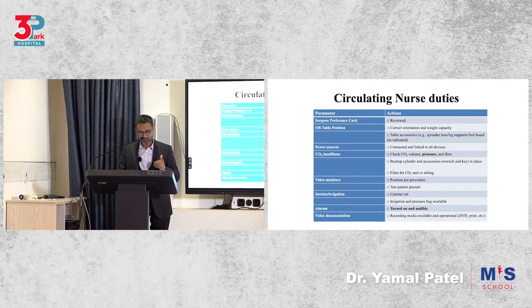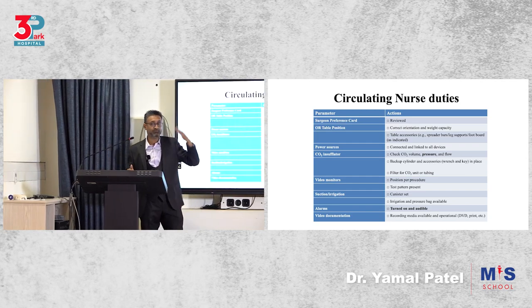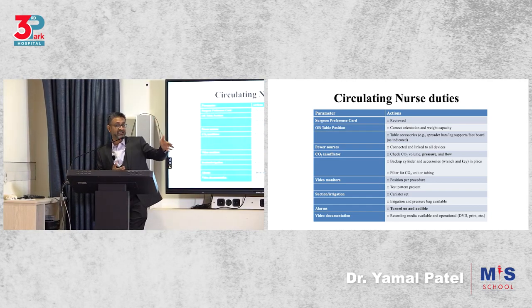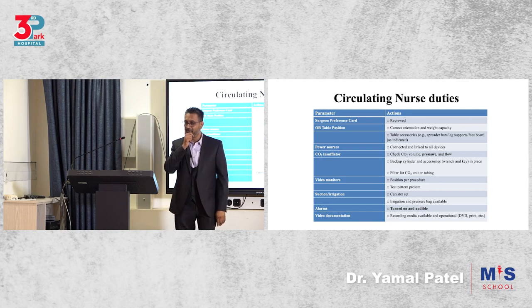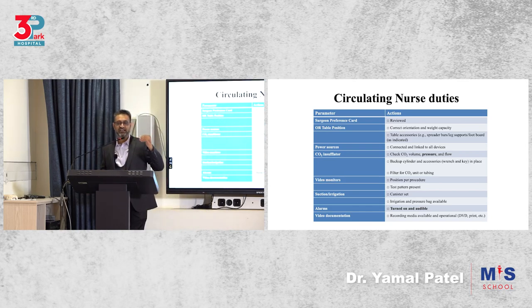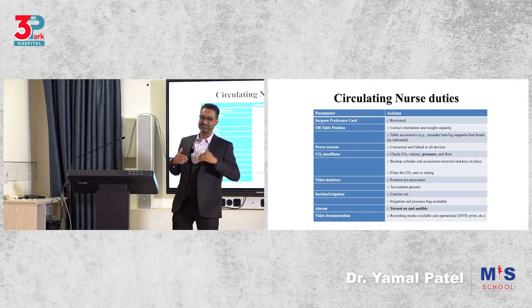Is my video monitor in position? Is it too high? Is it too low? Is the distance appropriate? So put it there, okay? Is the test pattern checked? Otherwise, when I'm ready to start is when you turn it on, and then you're waiting for 5 minutes for this machine to turn on, and you're trying to find out what happened. Why is this machine not turning on? That's wrong. That's a waste of time. Your checklist should tell you, do it. I see people smiling. I know these things must be happening, all right? But you see what I mean?